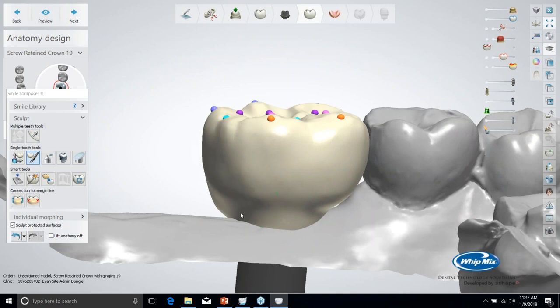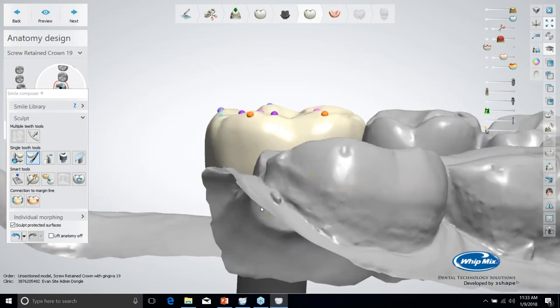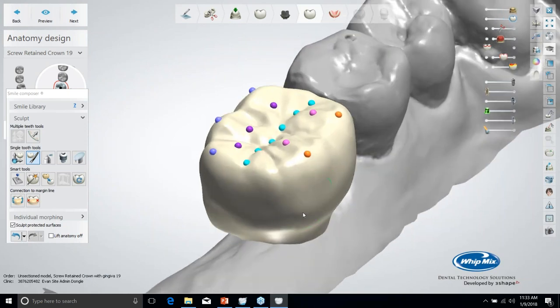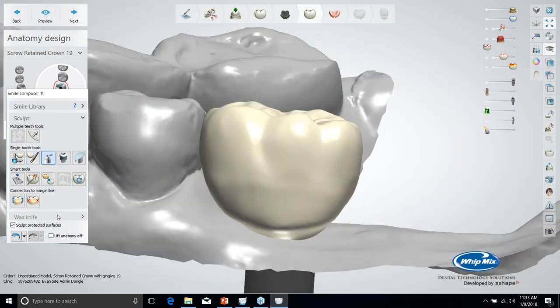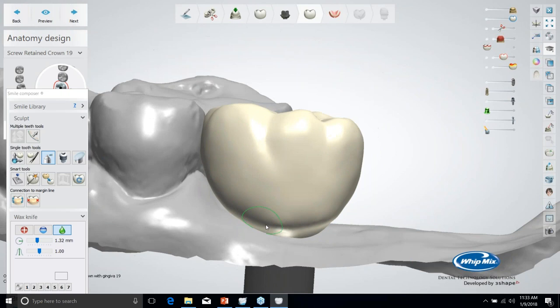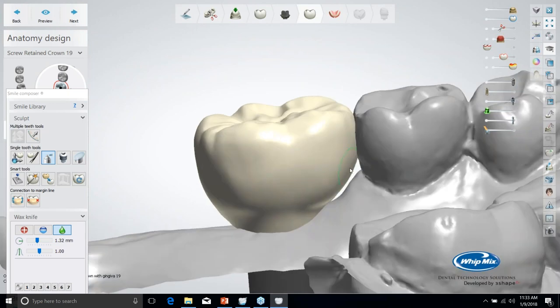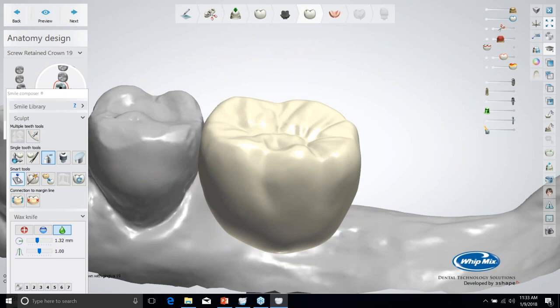Do a little bit on the lingual. And we'll smooth up where it made that adjustment. It's where we kind of see that line on the buccal. And we'll go ahead and cut our contacts under Smart Tools.